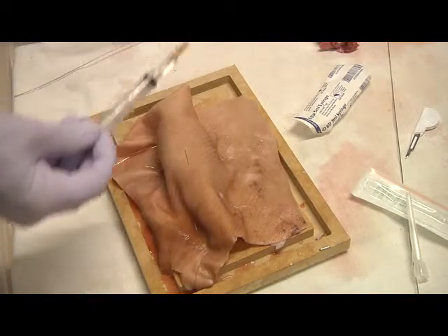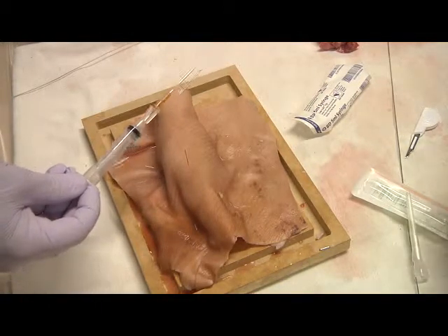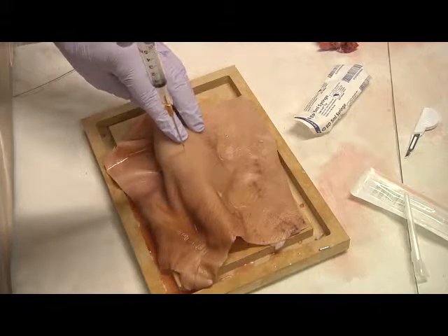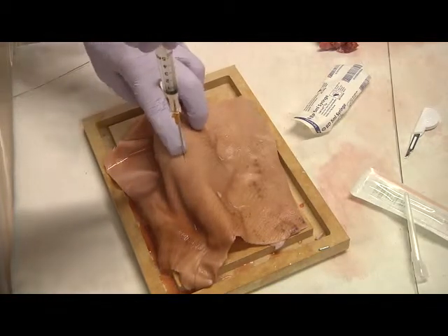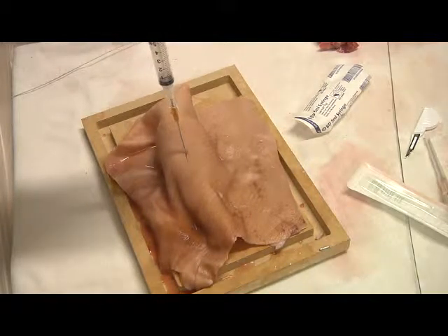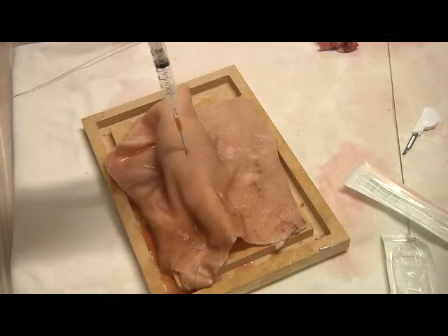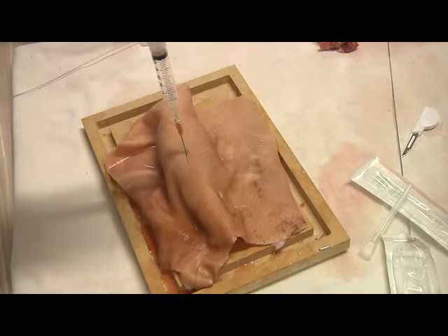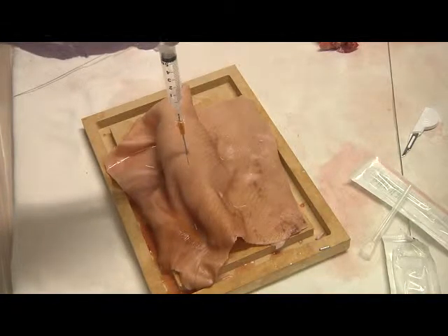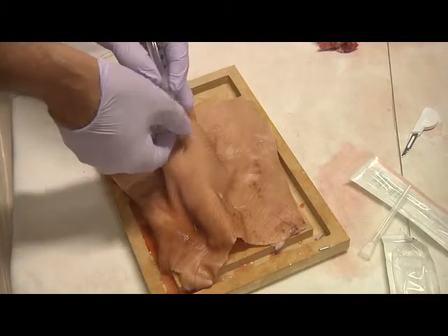Take our syringe and needle, and now the kit comes with either a stainless steel needle or a 20 gauge angiocath. I actually prefer the stainless steel needle. You're going to place the needle through the incision, 90 degrees to the plane of the C-spine, and the reason we do that, if you go too far, you'll hit the backside, and as you go, you want to aspirate as you go, and you should get a pretty clear aspiration of air. And frankly, on this model, that can be tough to find, but it should be absolutely clear when you have the aspiration of air. Once you have the aspiration of air, you can dip down and point it in a caudad direction and push a catheter into the larynx.